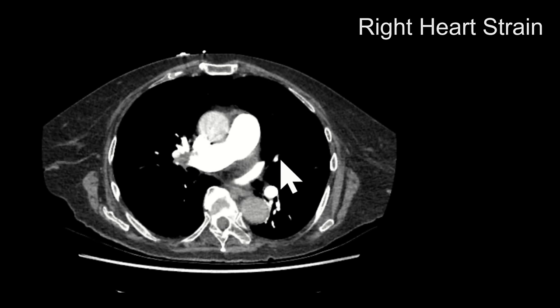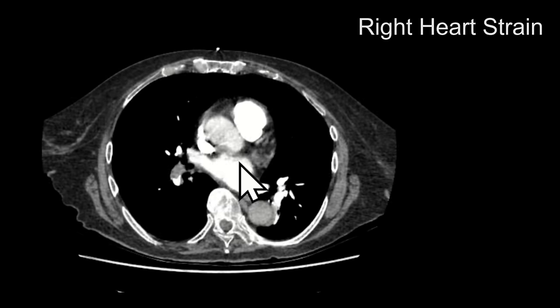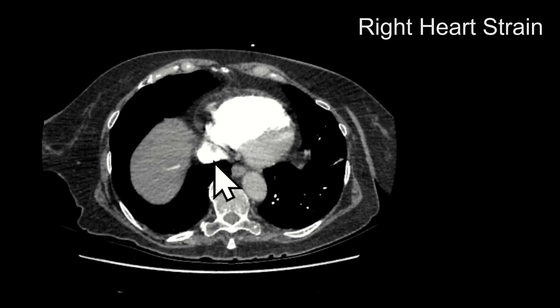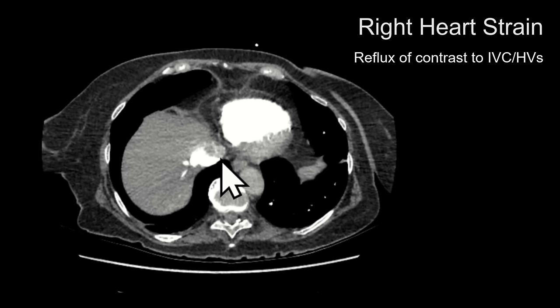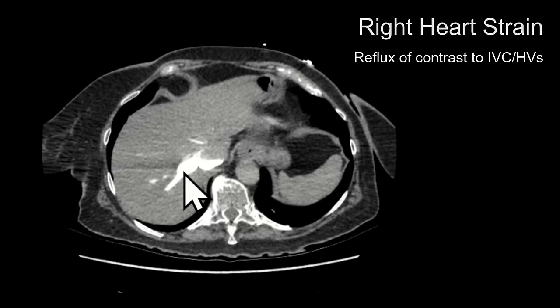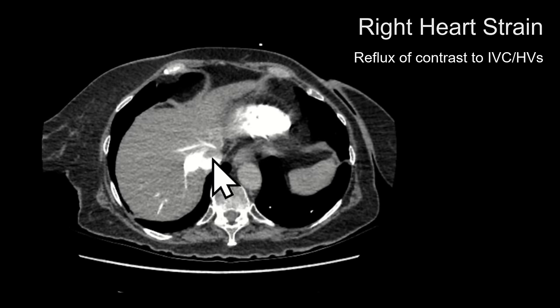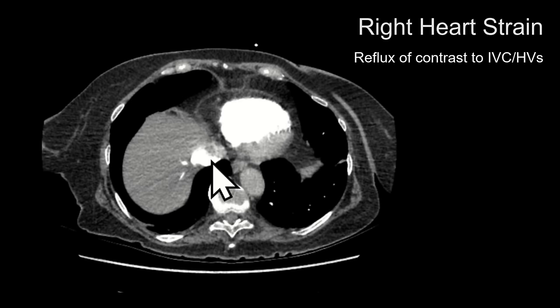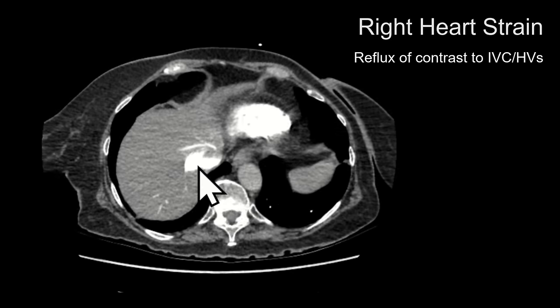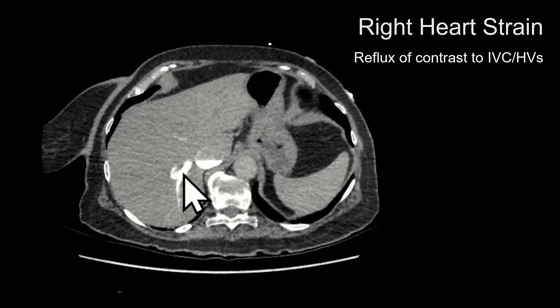In this other case, you want to look for the following signs of right heart strain. First, look for contrast reflux into the IVC or inferior vena cava and the hepatic veins. Notice the hepatic veins are well opacified with contrast here on this CTPA. You may see some contrast refluxing into the IVC even without right heart strain, but if it extends into the hepatic veins that suggests right heart strain.